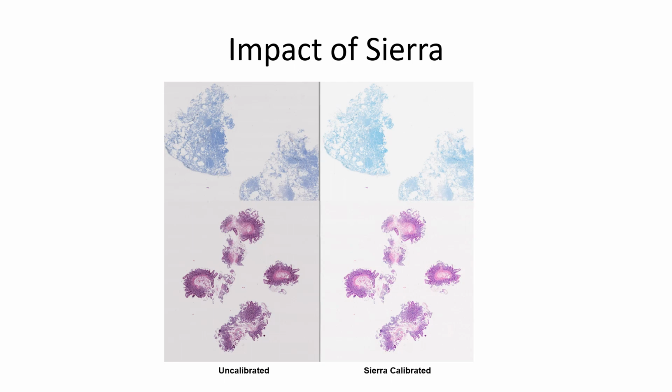And we can see here the potential impact. The uncalibrated image is on the left, and if you apply the characterized correction curve, the ICC colour profile, you can see that you can correct to a better presentation, arguably.